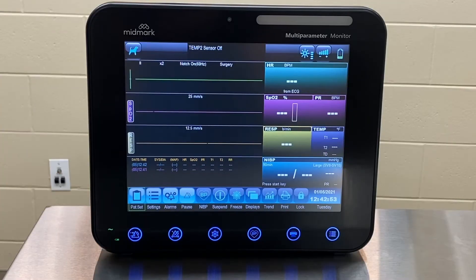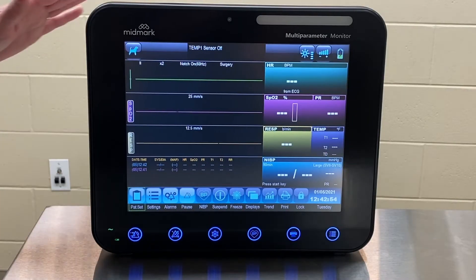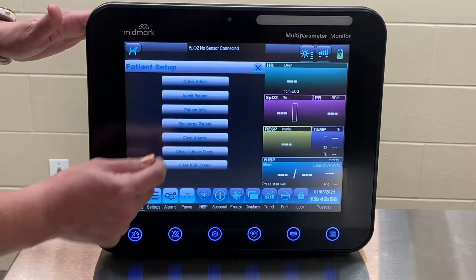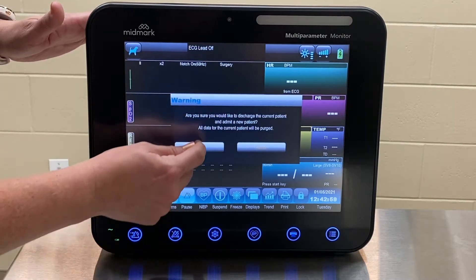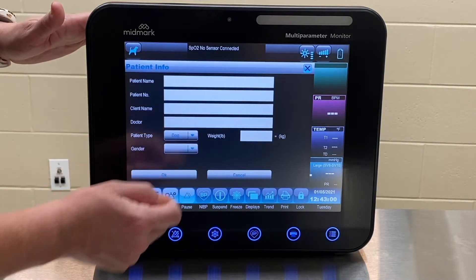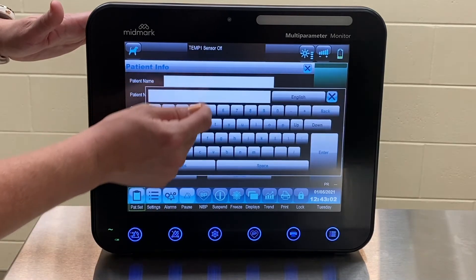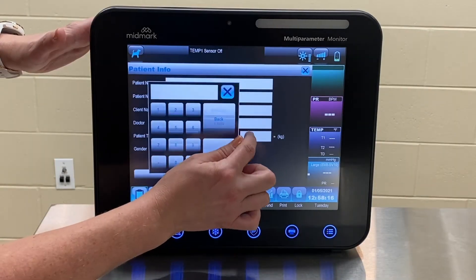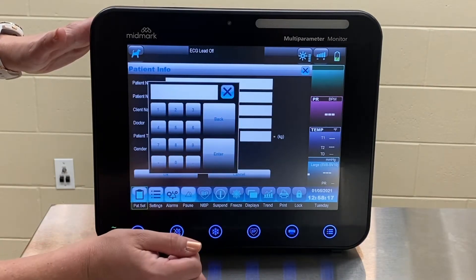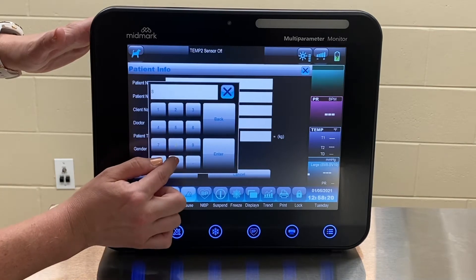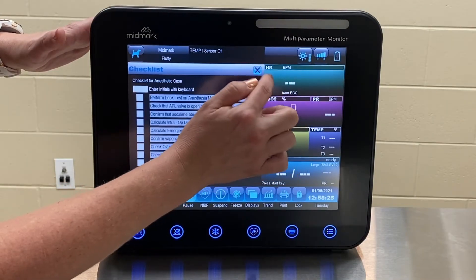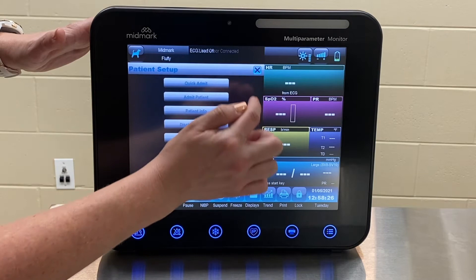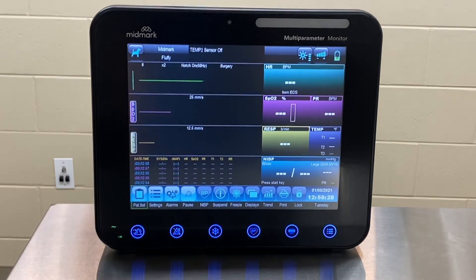To enter new patient data, press Patient Setup and select Admit Patient. Select OK on the pop-up box. This will clear out the previous patient information prior to admitting a new patient. Next, enter your patient information and press OK to save. To return to the main screen, press X in the upper right corner.